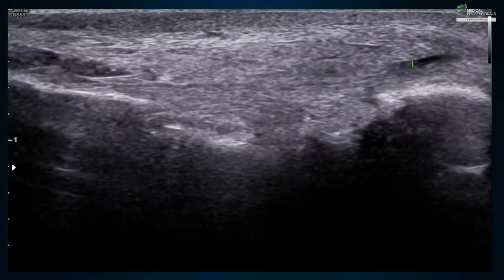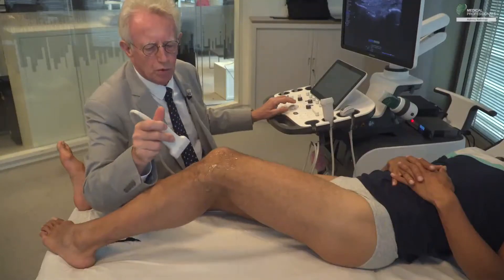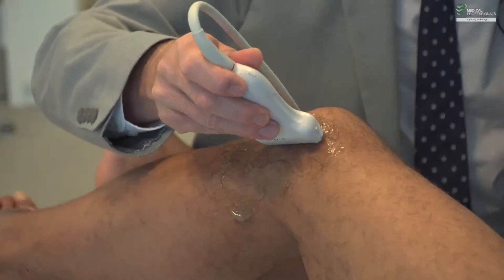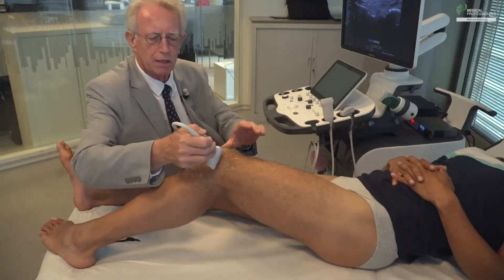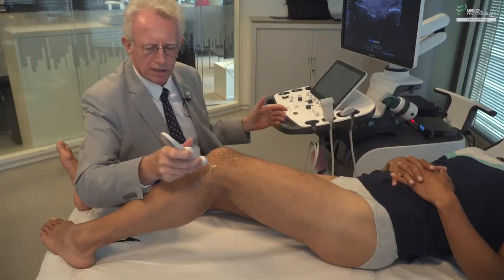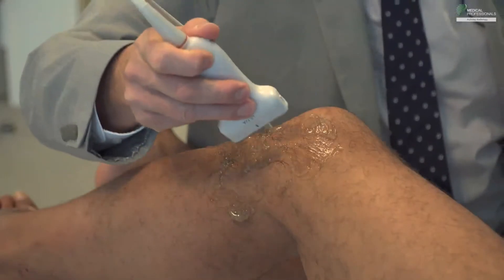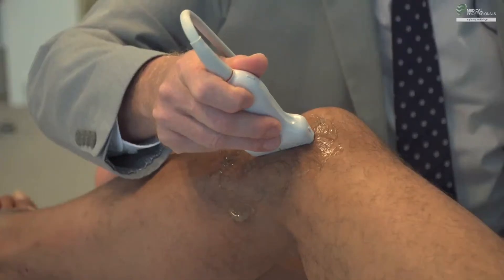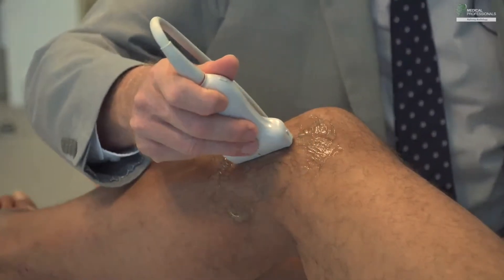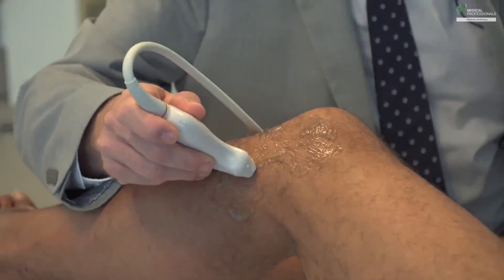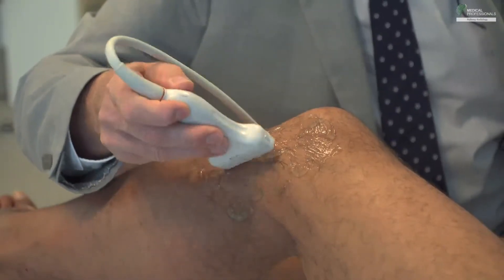To summarize so far: we saw the iliotibial band and its passage on the lateral aspect of the condyle; we performed the dynamic maneuver to check if the cul-de-sac crept between the band and the condyle; we looked at the anterolateral ligament; we identified the femoral hollow with the departure of the popliteus tendon; we followed the lateral collateral ligament through the biceps tendon to its myotendinous junction in both sagittal and axial planes; and we looked for a possible accessory insertion of the biceps tendon on the tibial plateau.